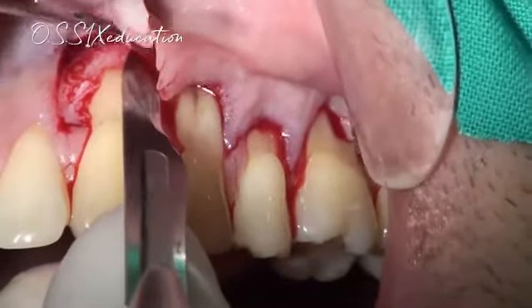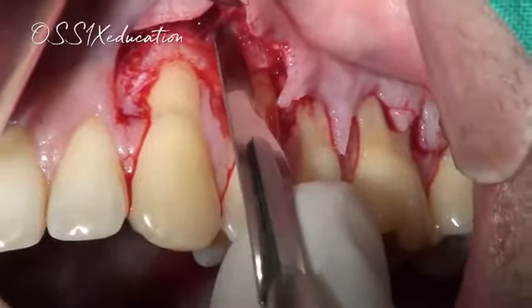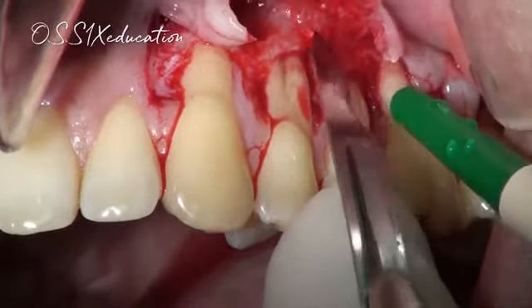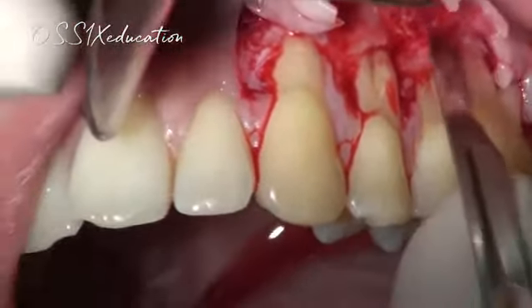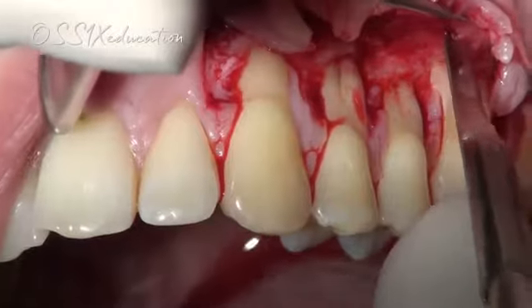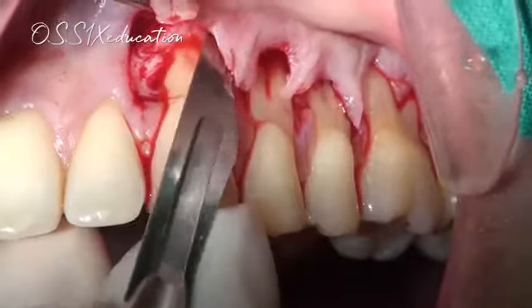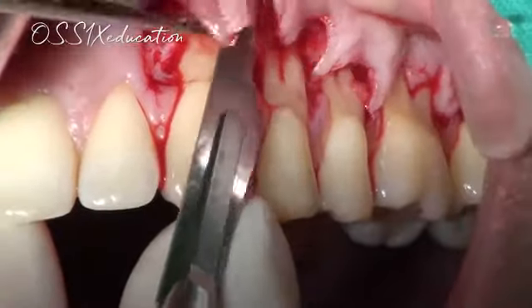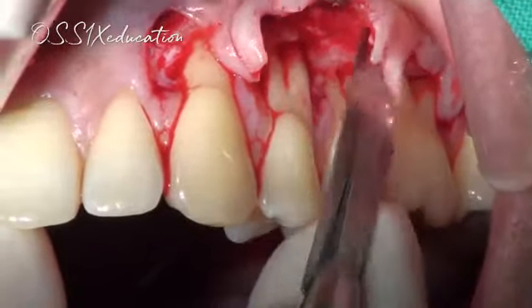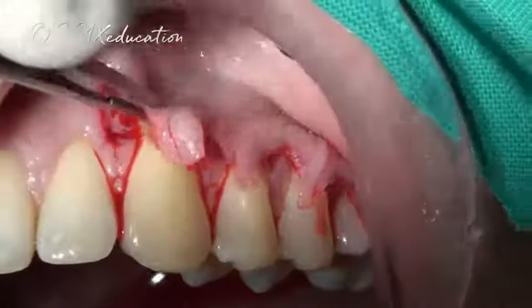These first gentle incisions are periosteal incisions, so we're detaching the flap from the periosteum. Slowly, gently, I raise the flap so you can nicely see how it's cut. And always use a sharp new knife, so change the blades as often as you can. Now we are detaching the muscle fibers from the flap. We're going parallel to the bone, cutting the muscle fibers that are attached to the flap so we can achieve passive closure.